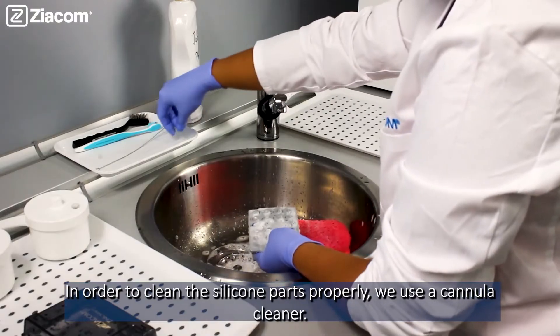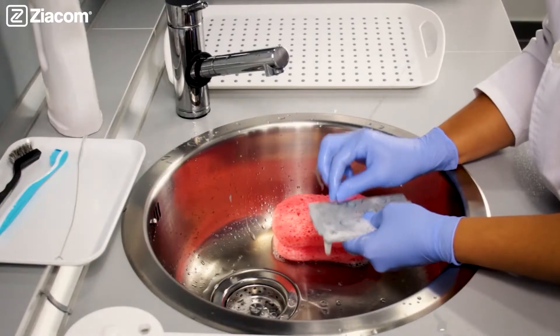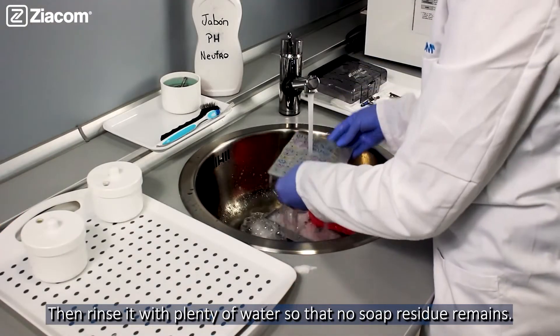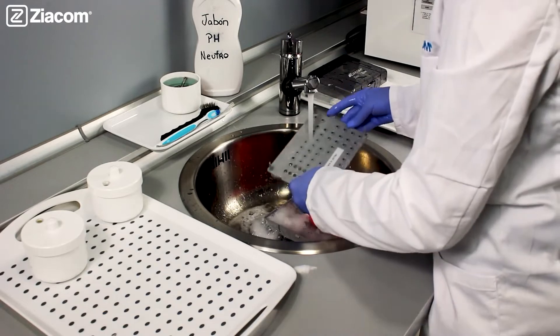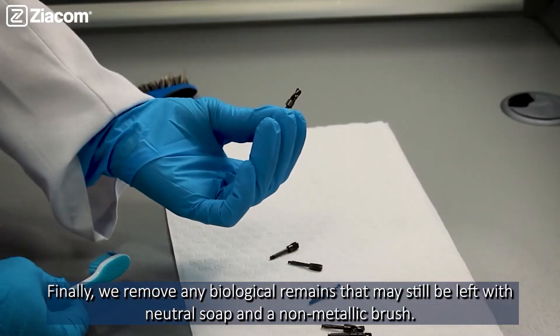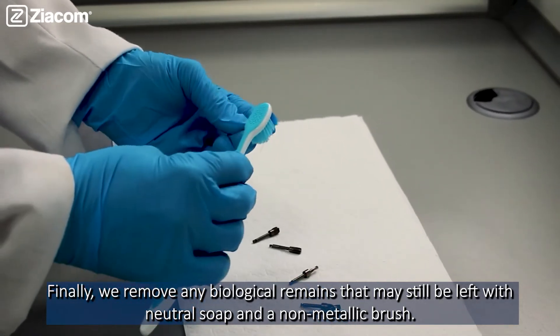In order to clean the silicone parts properly, we use a cannula cleaner. Then rinse with plenty of water so that no soap residue remains. Finally, we remove any biological remains that may still be left using a neutral soap and a non-metallic brush.